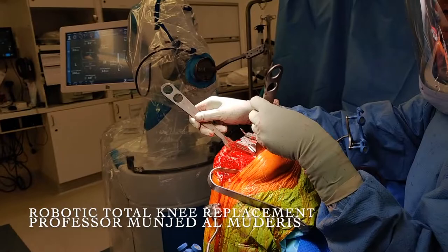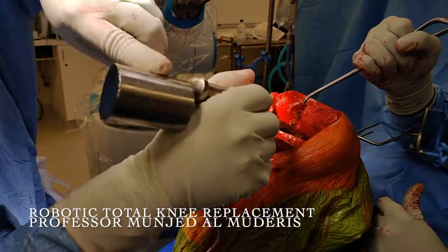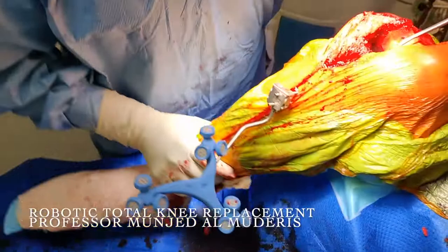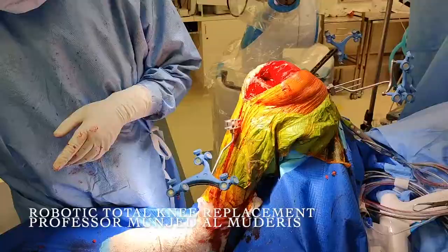After performing the final cuts, we remove the block. I finalize the cuts by addressing the posterior aspect of the condyle using an osteotome to maximize flexion. Once I am satisfied with the posterior cuts, I check in full extension to assess balance and any bleeders. I then recheck in flexion and the knee appears very well balanced. We can proceed to finalizing the tibial cuts and inserting the implant trial.